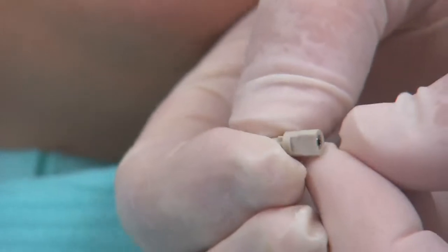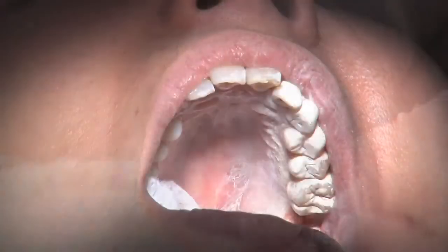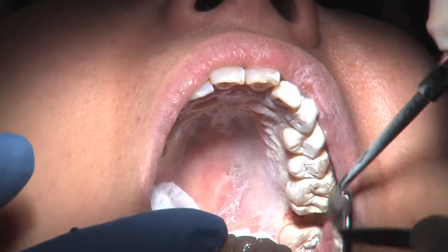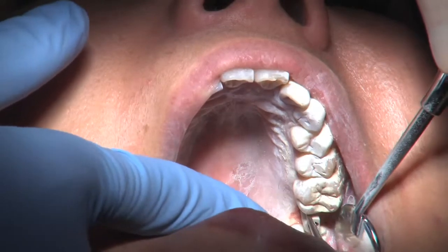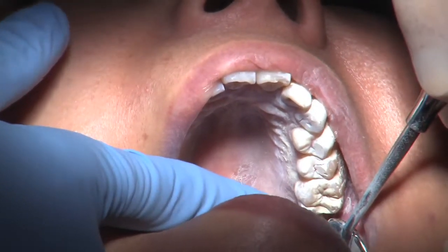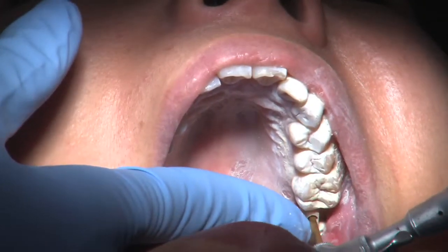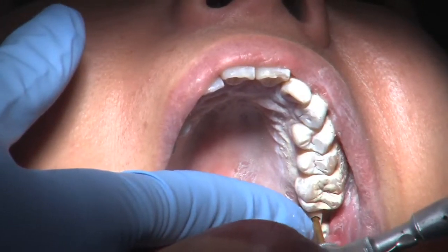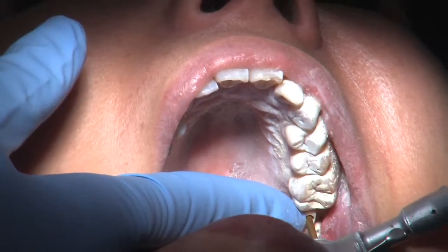A scanning abutment is then utilized to capture the position of the implant, including the abutment connection. This case involved using no-bore replace implants, and you can see the tri-lobe abutment connection. To get the most accurate impression, the scanning abutment should be seated so the flat face is towards the buccal or lingual. In this case, we had it facing towards the buccal.